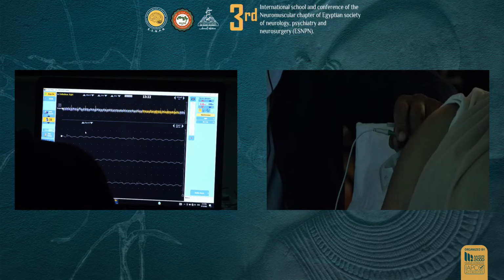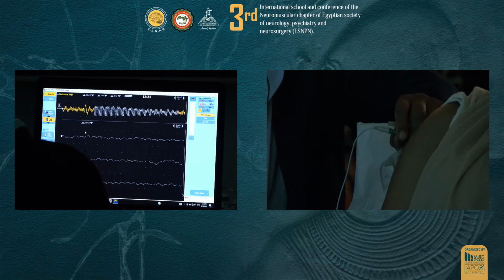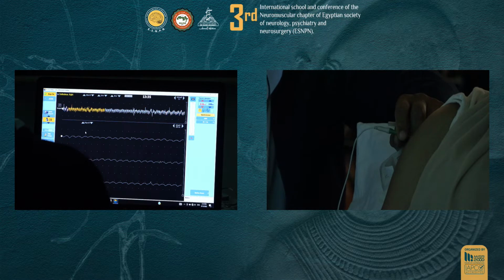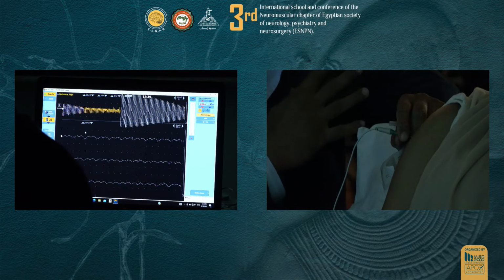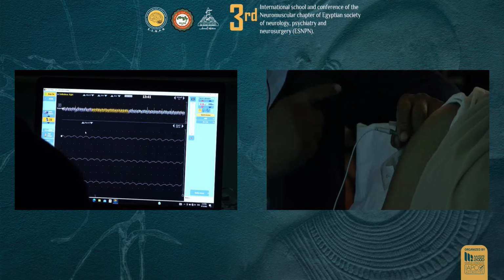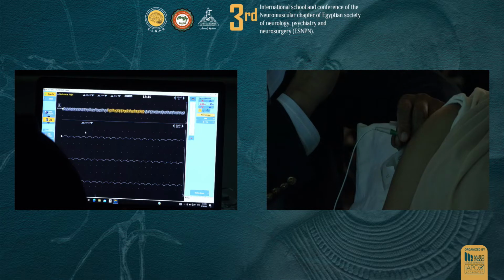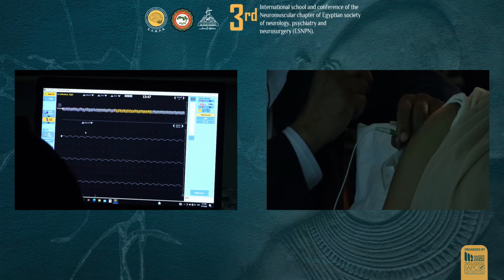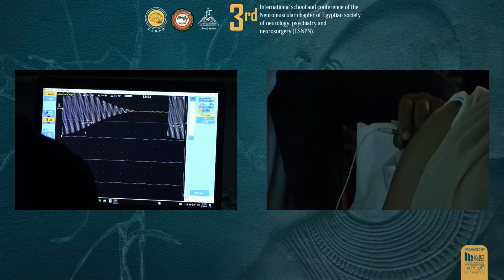The reason I say it's motor unit and not spontaneous activity, I can tell you why. There are a few reasons. One, it's semi-rhythmic, it's not rhythmic. I'll show you an example of spontaneous activity. It's not a fasciculation, because a fasciculation fires, boop, stops. Boop, just like when you see it, suddenly it fires and stops. It doesn't fire repeatedly. So hearing just a semi-rhythmic pattern tells you it's a motor unit, as compared to a fasciculation or fibrillation, and the firing frequencies are totally different.